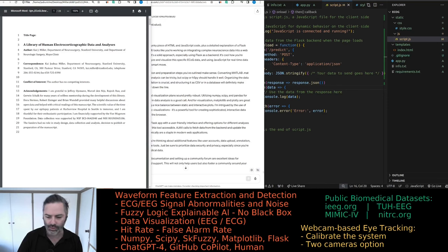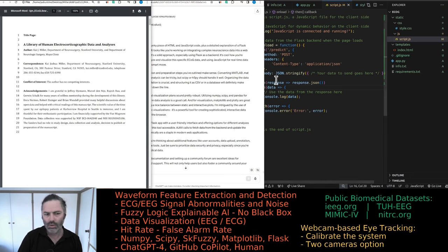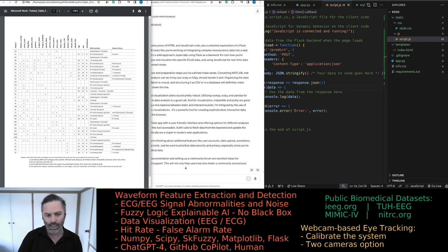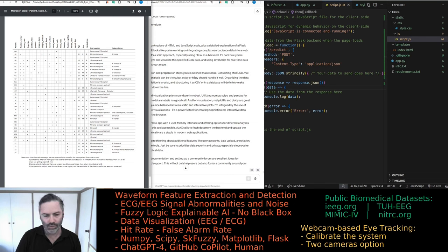We're going to be going over this paper today — well, actually not going to be reading it as the title suggests. It has the data associated with it, so we're going to be looking at the dataset. It's a large dataset with many patients, and they did all these tasks while having electrodes implanted. We'll be looking at this data and what we can do in terms of a Flask application for displaying and processing the data.